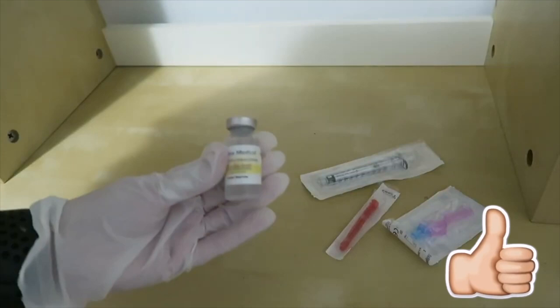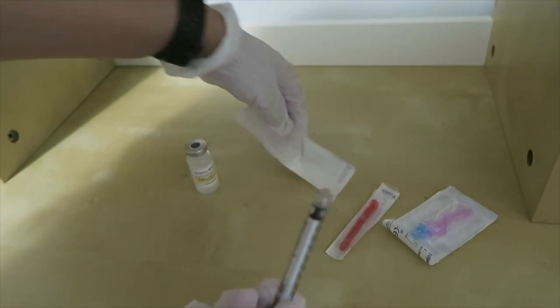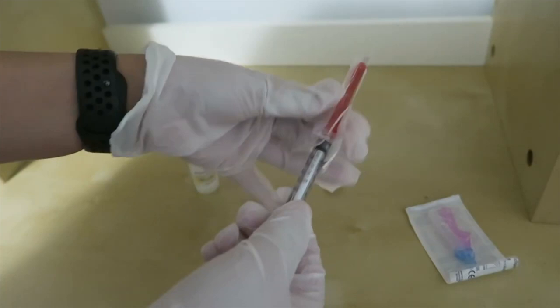So here I have the vitamin B12 complex. And by using an alcohol swab, I'll be wiping the top of the bottle, making sure that it is nice and sterile and disinfected. I'm also going to use sterile technique to connect the blunt fill needle to the syringe.